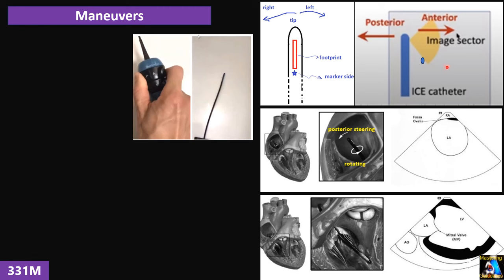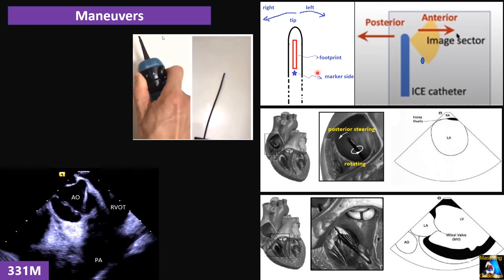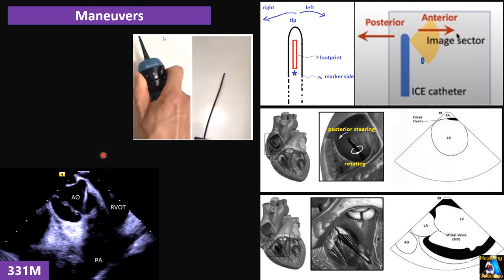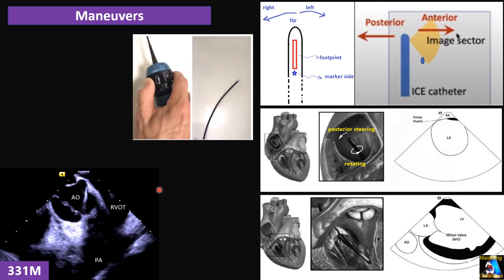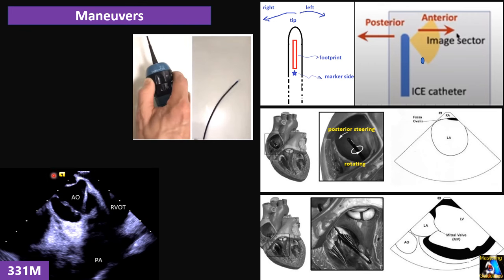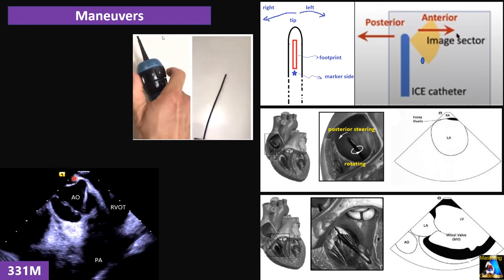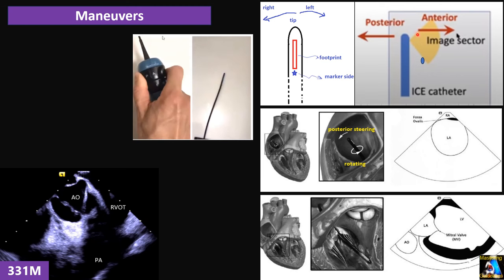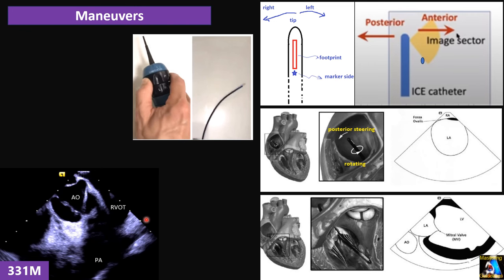Second, the orientation of the image on the monitor is different from the other two modalities. On TTE and TEE, the marker side will be on the right side of the monitor, our right side. But on ICE, it will be on our left side. So knowing that is important. This side of the sector image belongs to this side, and vice versa. That is the first thing we have to know.